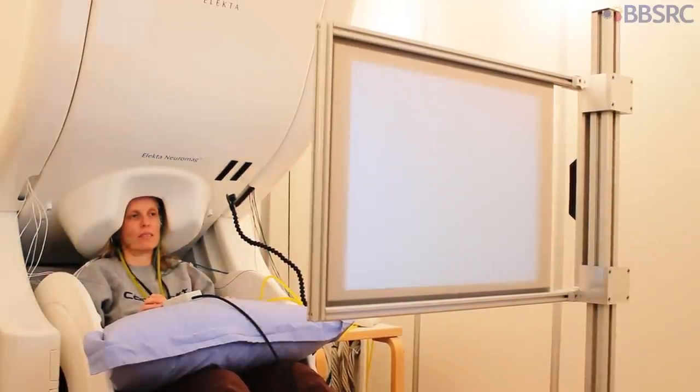But we're not sure whether that's a consequence of changes in the brain's blood supply as we age, or actual changes in neural activity. This is what the MEG scan can tell us. It can separate out true changes in neural activity from changes in the brain's plumbing, if you like.